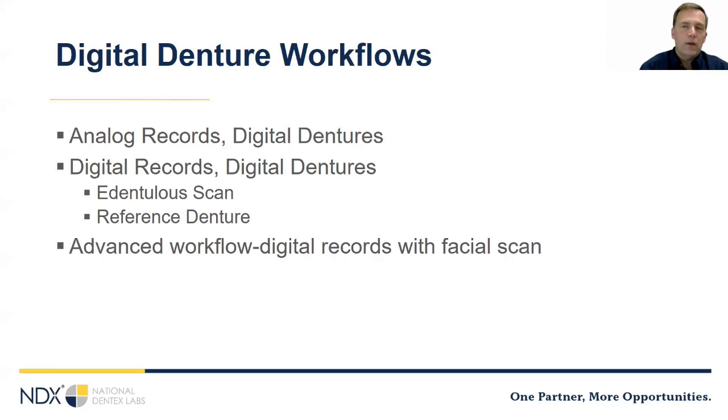Some labs do post-dams on their maxillary dentures that are printed, and some don't, because the post-dam fundamentally is compensating for that 8% shrinkage. And so when the whole thing fits, you don't need to compensate for shrinkage. So you'll kind of want to work with your laboratory, but usually you'll be using a much less aggressive post-dam if you're doing one on digital dentures than you would with an analog denture.